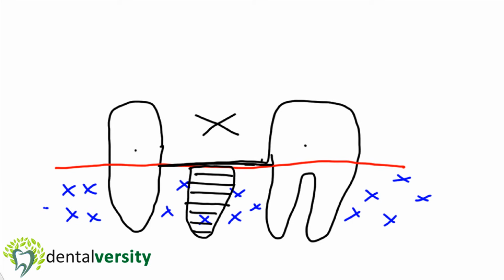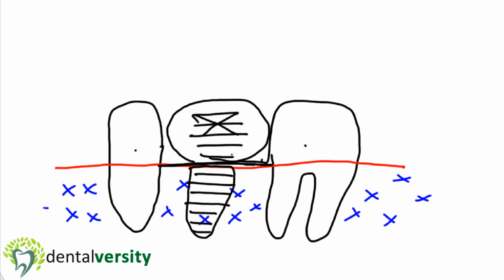So once the implant is healed, then a tooth can be placed on top of the implant. And virtually, once the tooth is placed on top, it is pretty much like a whole brand new tooth. And another great advantage you can see here is that, look, where I'm drawing the arrows, we can floss in between, and we can keep the area nice and clean without having to fiddle with floss threaders and trying to get under that bridge to keep it clean.